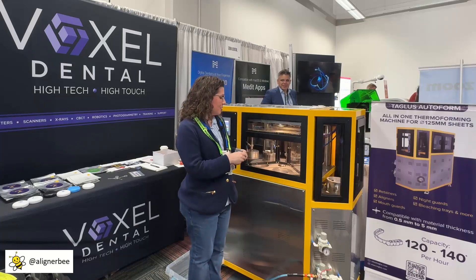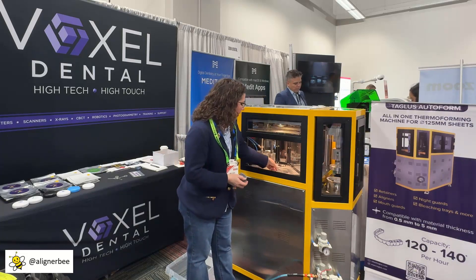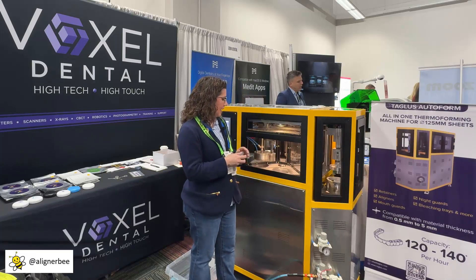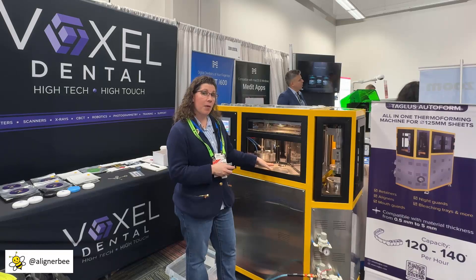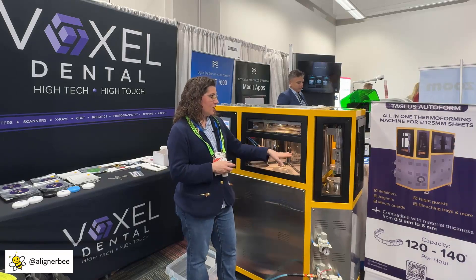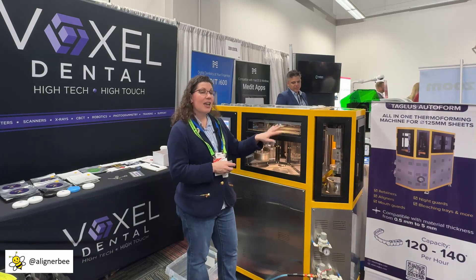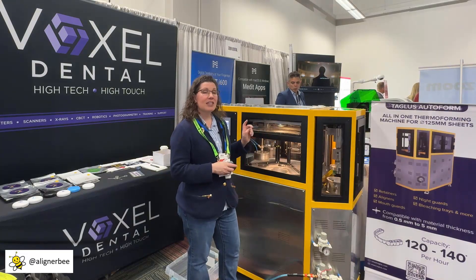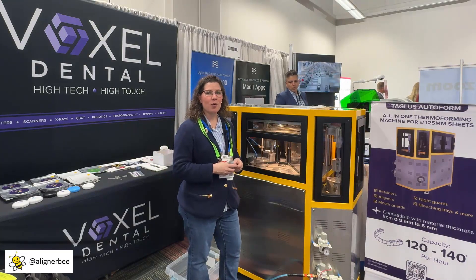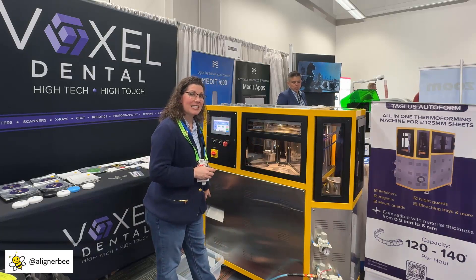We can see here the machine operates based on a spindle. We're going to feed the models in, and it will go through the process, moving from the model where it's loaded to the step where the thermoforming material is placed over it. It will then go through a heating process, and after the heating, the pressure forming will be completed, and then the model will come out here on this side.